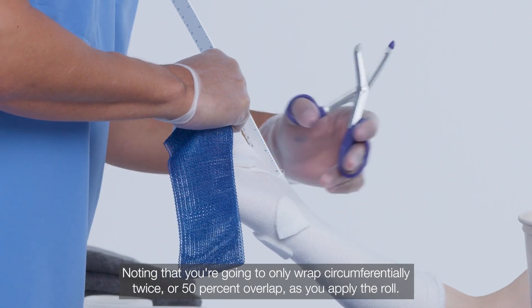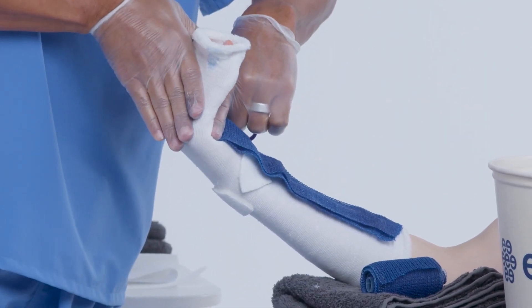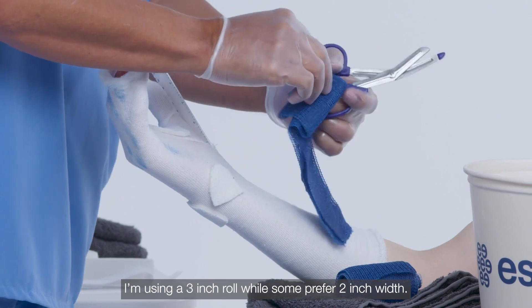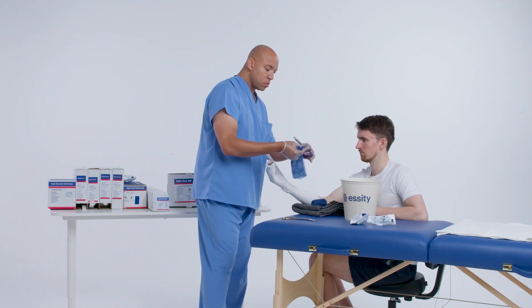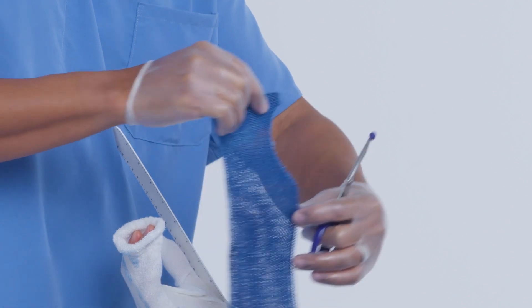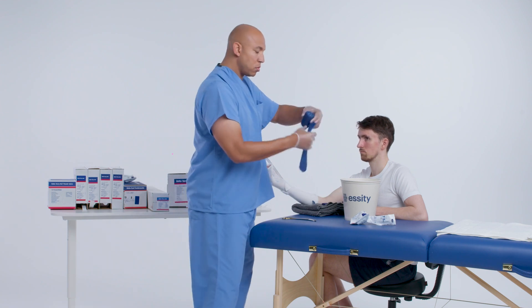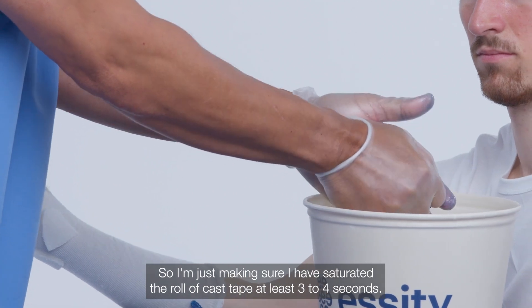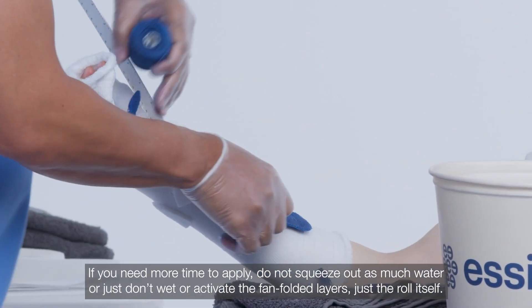You're going to wrap circumferentially twice or with 50% overlap as you apply the roll. I'm using a three-inch roll, while some prefer two-inch width. I'm making a half moon cut for easier trimming around the thumb. Soak the roll three to four seconds and ensure the fan-folded layers are laid smooth prior to applying the roll. If you need more time to apply, do not squeeze out as much water, or just don't activate the fan-folded layers — just the roll itself.